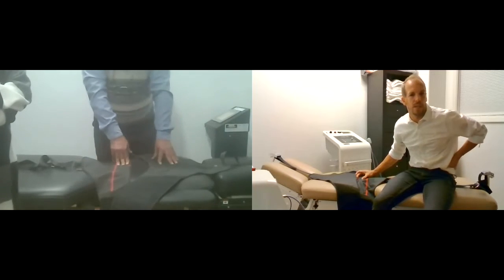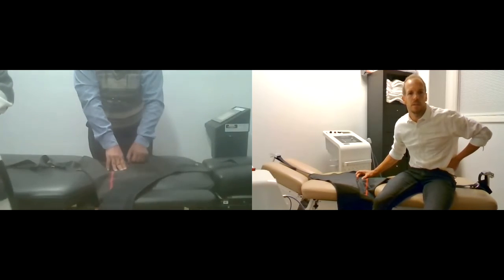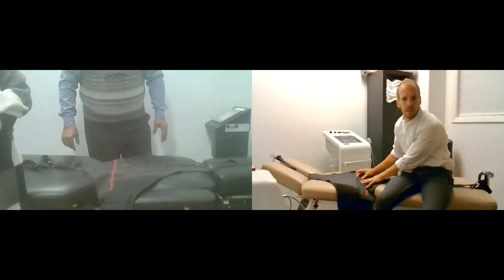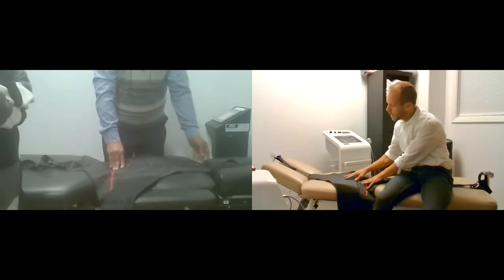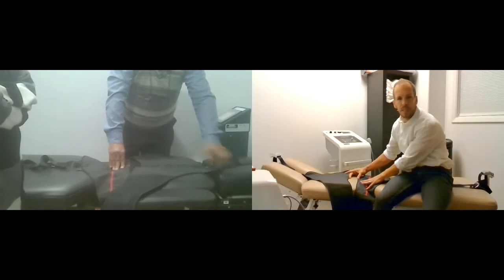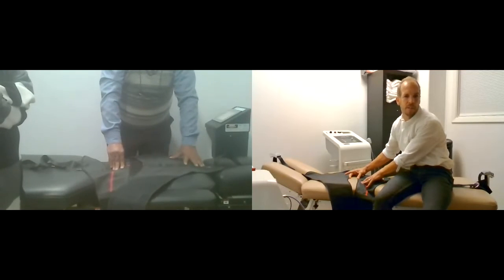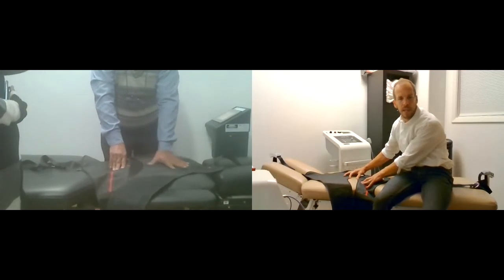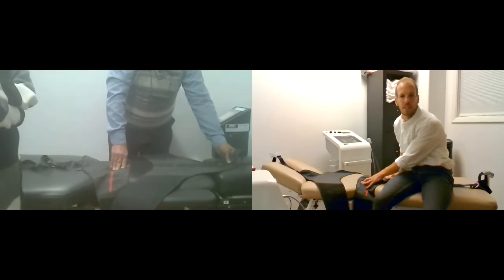That's for your shortest patient. Now, as the patient gets taller, the pelvic harness stays no matter what. This upper harness slides up. About 2 to 3 inches would be an average size male, so about 5'11" to 6 foot tall would be about 2 to 3 inches here. 6 feet tall to 6 feet 5 would be about 5 to 6 inches here.